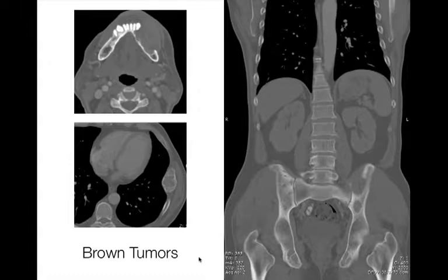But maybe if you saw that mediastinal mass and you were able to think that, hey, could this be a parathyroid adenoma causing all these brown tumors, which is probably a bit of a leap because probably not your first thought. If you see a mediastinal mass and multiple bone lesions, you're going to think some kind of scary malignancy in mets, but nonetheless, that's what this turned out to be.